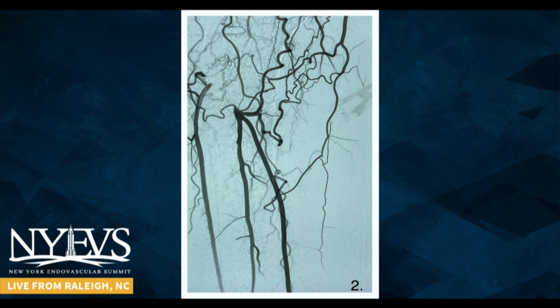We were able to come from a contralateral femoral approach. In retrospect, if I would have known what we were dealing with, an antegrade approach would have been nice, but that's what we had. We also accessed the posterior tibial. We did a double balloon technique, and then we were able to fenestrate the lumen, a 4.0 balloon from above, 3.0 from below. From above, we traversed the lesion through the anterior tibial, then ballooned into the anterior tibial, first and foremost, back through the popliteal and the SFA.